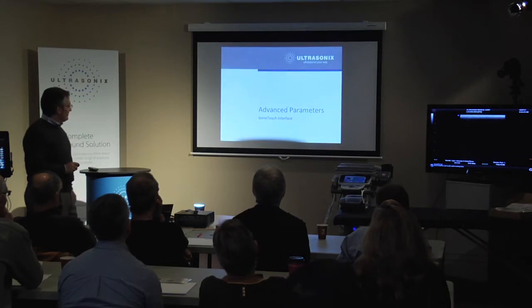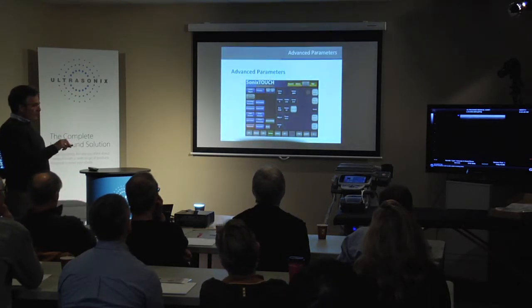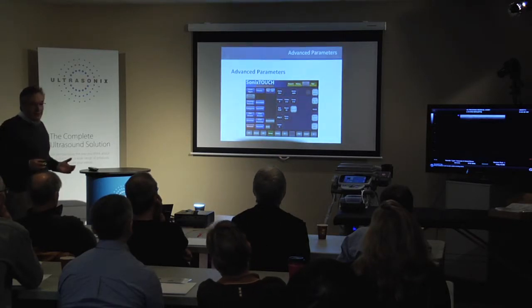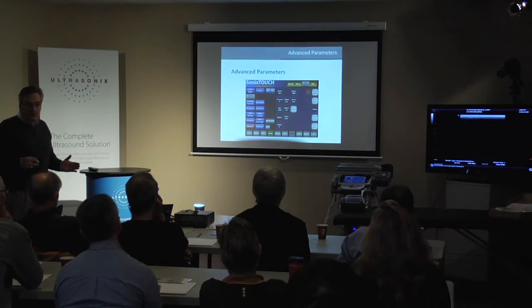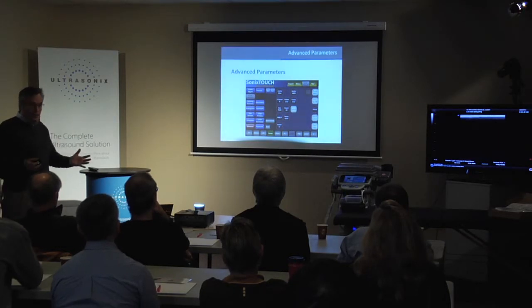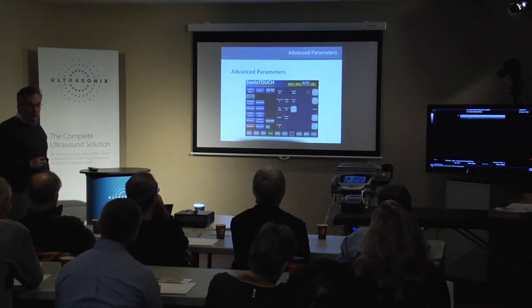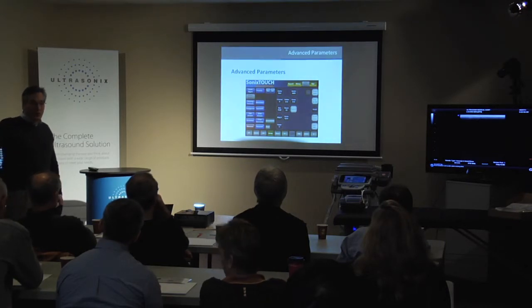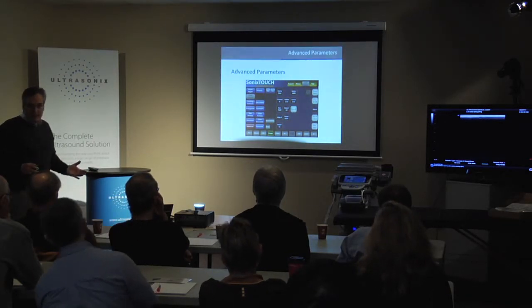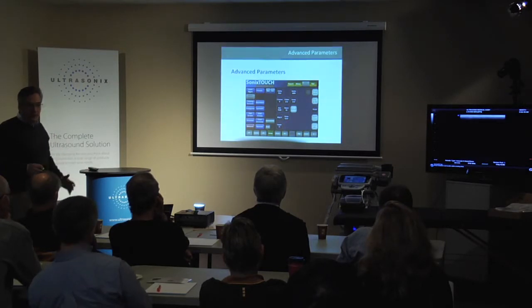Some of the advanced parameters can be chosen through the Q Sonix or the Q button. As a result, we enlist more of the ultrasound components and controls for more advanced utility and manipulation of the ultrasound image. This may or may not be of interest to you. The default will be the simple display, the larger buttons, more clear. But if you wish to enable greater control and manipulation of the ultrasound image that we'll have an opportunity to work with in the hands-on workshop, this is the appearance and presentation of the advanced setting. Your gain button, depth, all these shrink down to allow more buttoning controls from a sonographic perspective, eliciting better control and image manipulation.